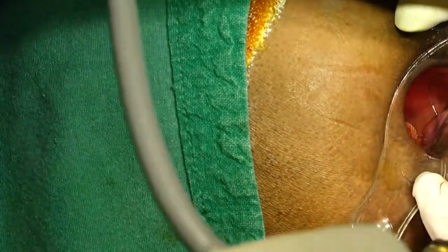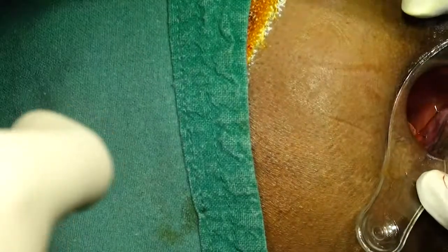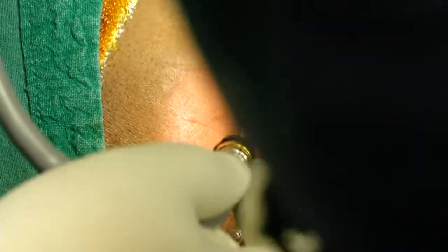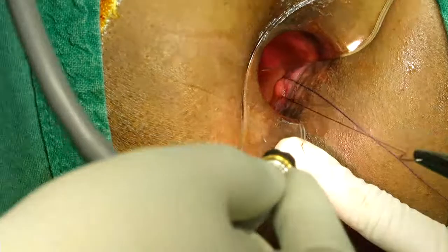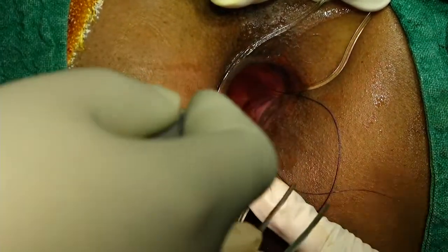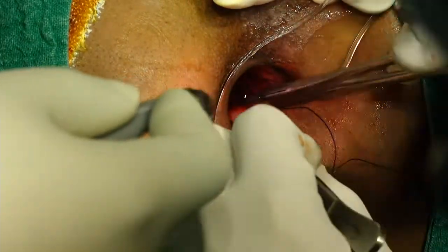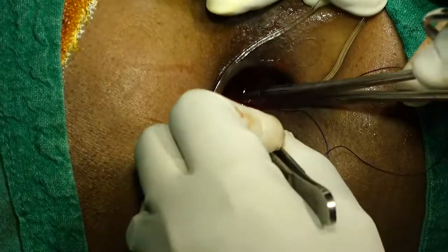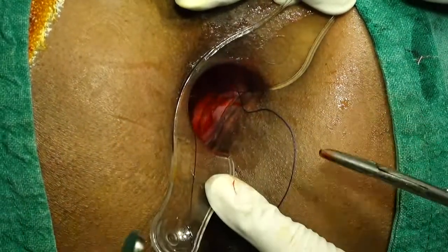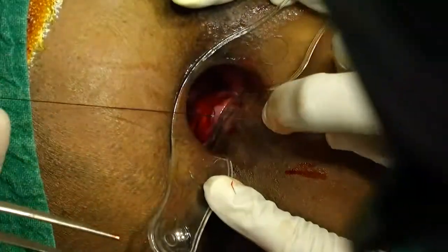de-arterialization. Sir, you can do the hemorrhoidal artery ligation. Perfect. Thank you, sir. We are applying this stitch. Whatever the method, the idea is to produce de-arterialization. Similarly, de-arterialization you can achieve by this. And by the laser also, you deliver the laser energy around the hemorrhoidal artery, it will produce inflammatory reaction.